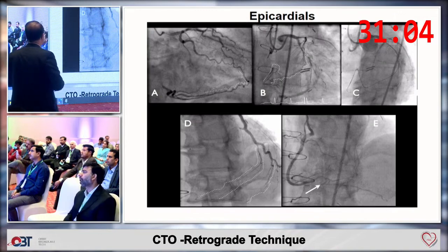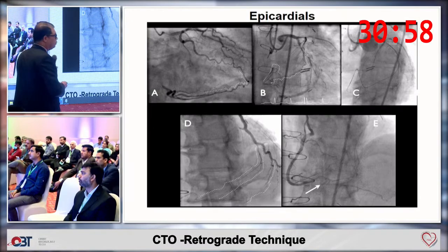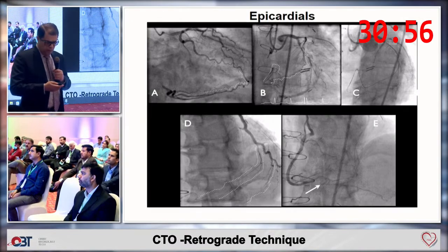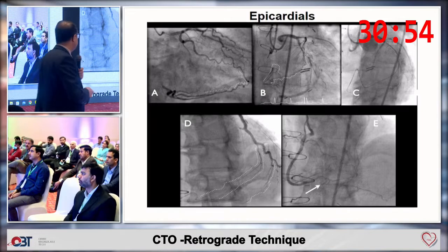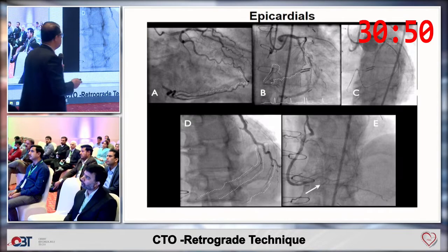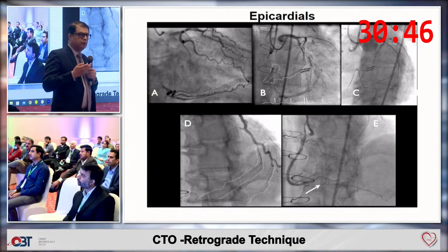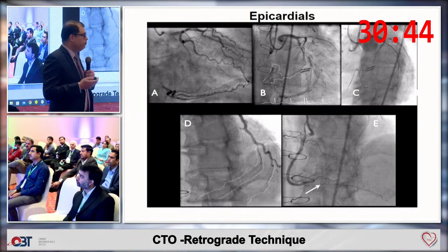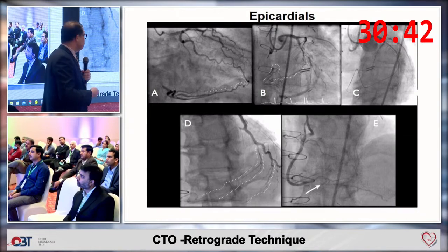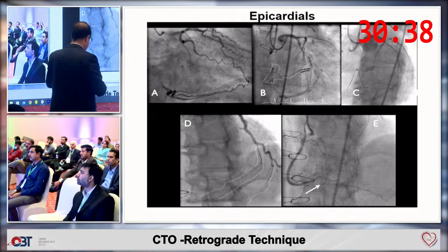So the epicardial collaterals. Initially, they were very feared collaterals because they can cause complications and rupture easily. Nowadays, people can safely do procedures with epicardial collaterals, but always start off your retrograde program with septal collaterals, which are safer. Once you have gained experience, then you can shift to the epicardial collaterals.